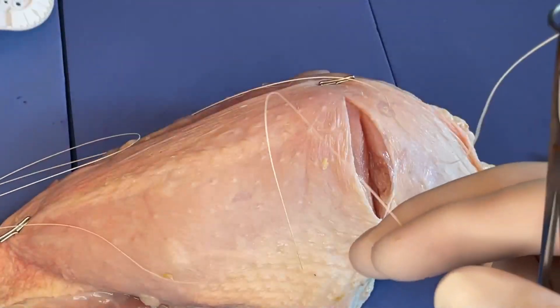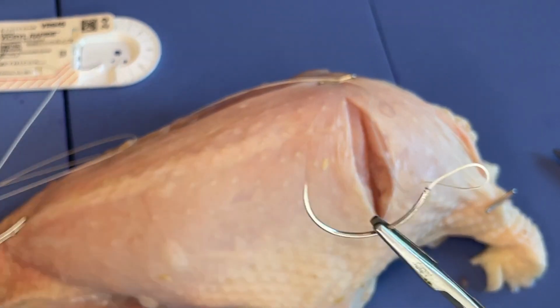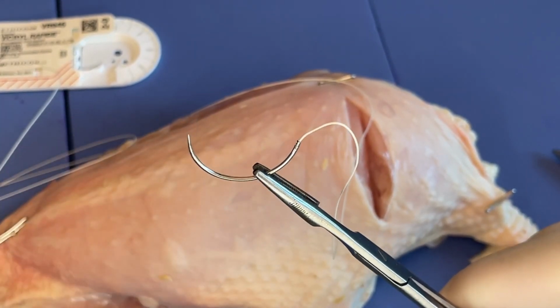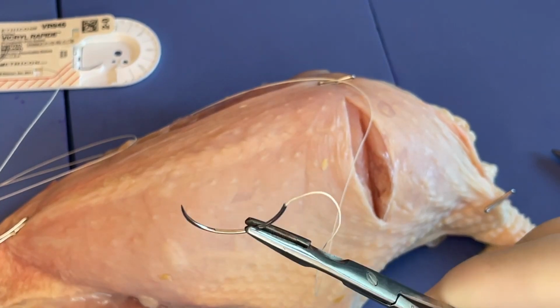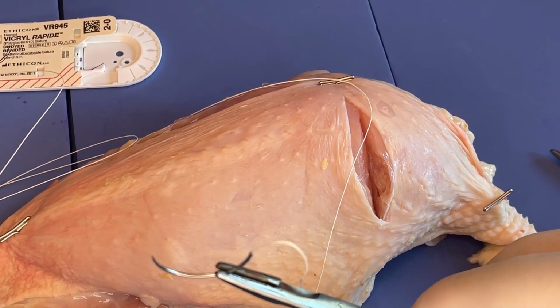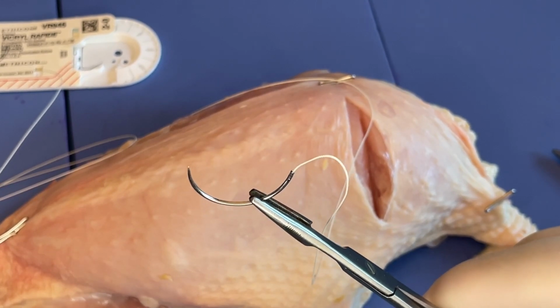All right, let's take a look at the needle to start with. The two parts of the needle that we don't really ever want to be grabbing with the needle driver are at the tip, because it will considerably dull the tip, especially if you have a cutting tip, and the swedged end where the suture is attached to the needle, because if you crush that area, it can loosen the suture and turn it into a pop-off accidentally.